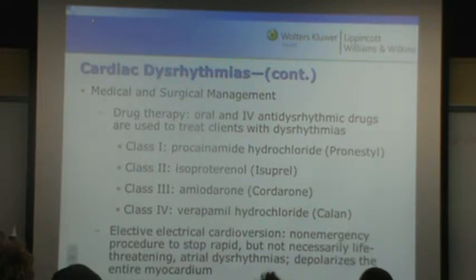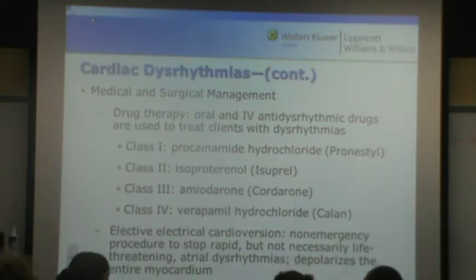Let's say we were going to cardiovert this SVT here. This is what's really neat about the way it works. When we use synchronized cardioversion, we're actually shocking the heart at a very specific point in time during the cardiac cycle.